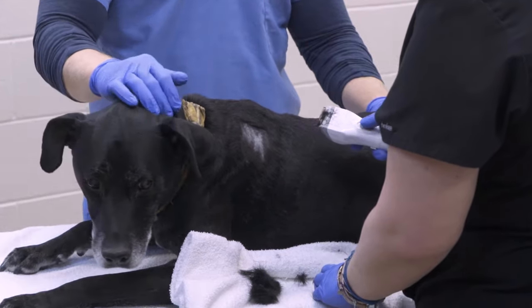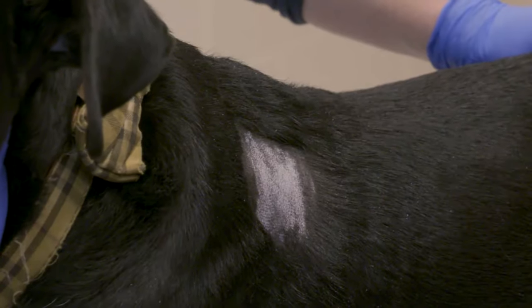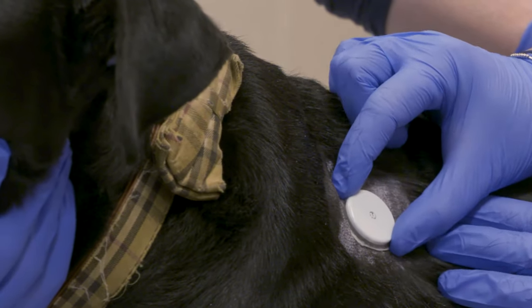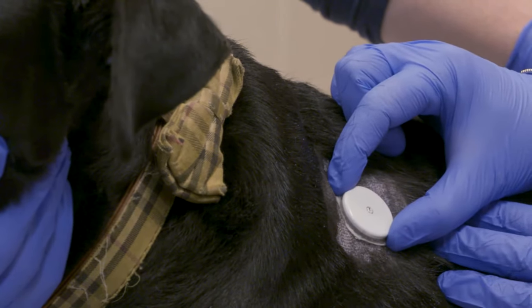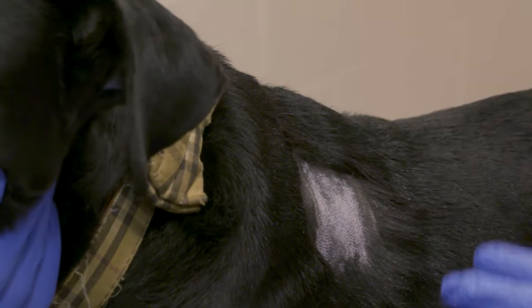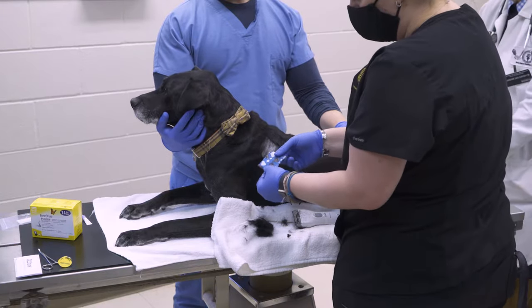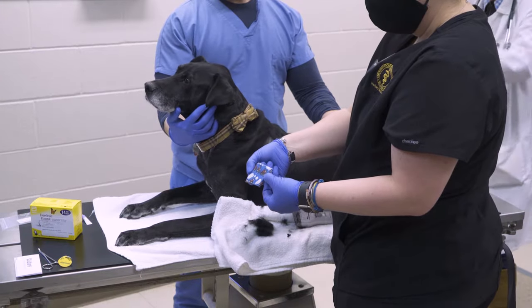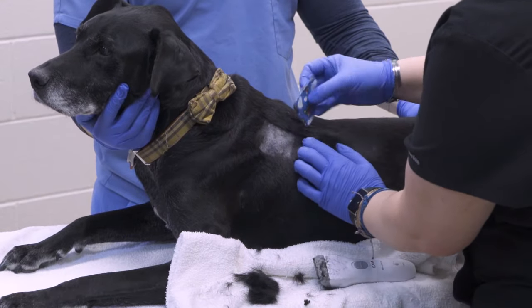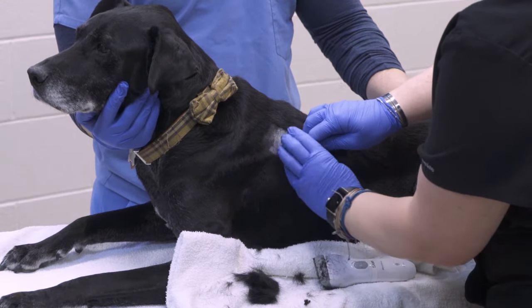We recommend clipping a region that is approximately a 4 to 5 centimeter square, which is slightly larger than the sensor that measures 3.5 centimeters in diameter. After clipping, the skin should be cleaned with alcohol and allowed to dry. An alternative is to use a bandaging product such as Vet Wrap to remove the hair, oil, and dander from the skin.